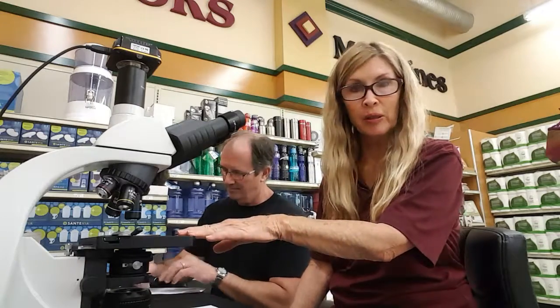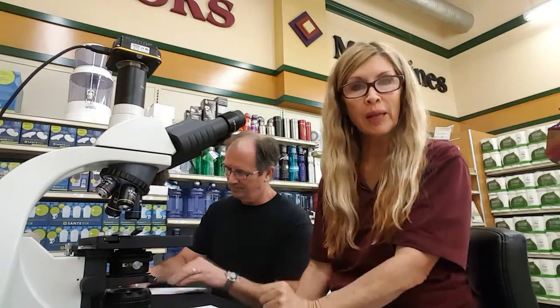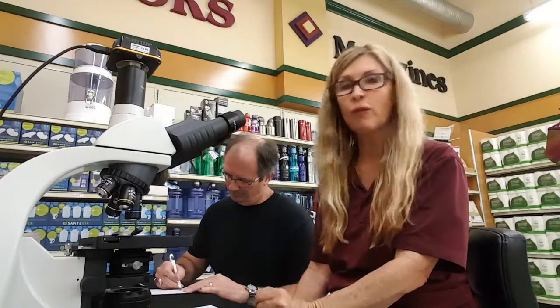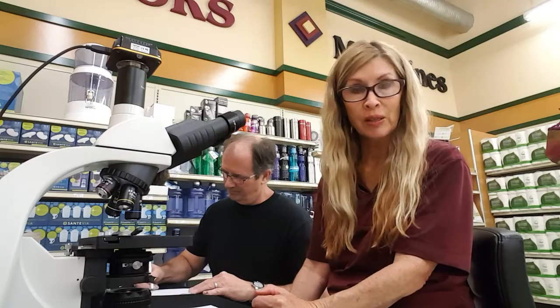And then he'll sign this. And then I go ahead and I'll prick his finger. And then I'll analyze it. I'll put it in the slide here. And the camera picks up on it. And it shoots it over to my laptop. And it's a nice big full picture. And then we analyze the blood. We analyze the red cells and the white cells.